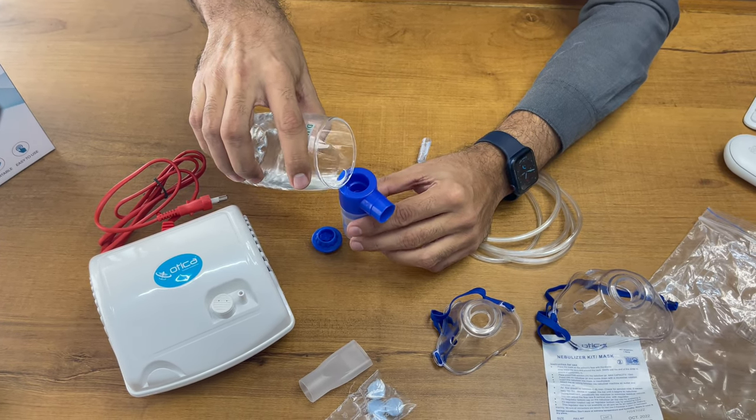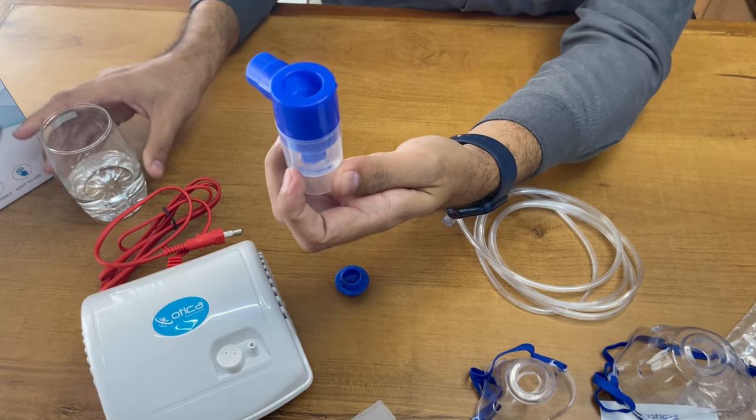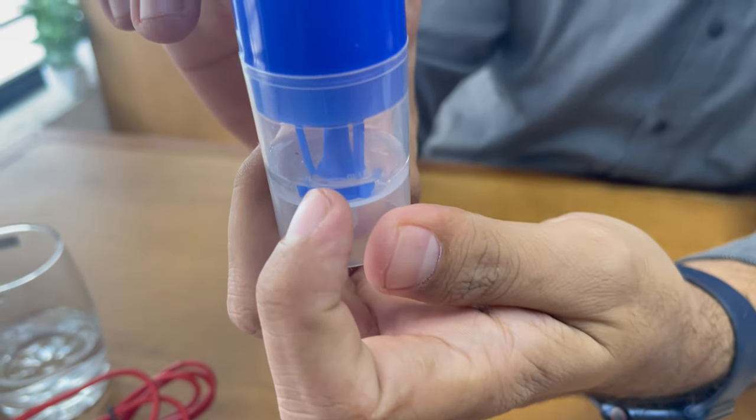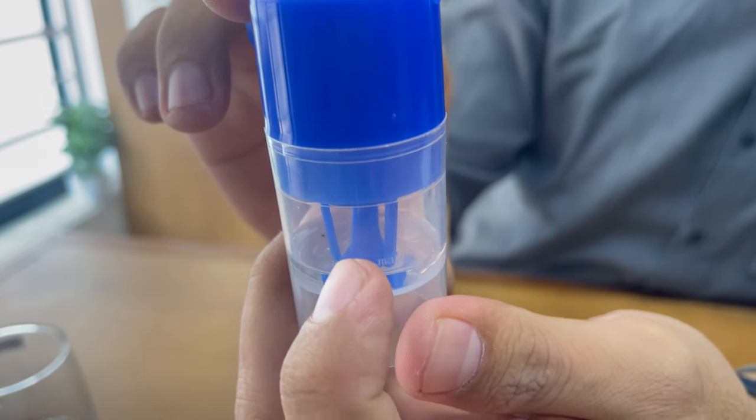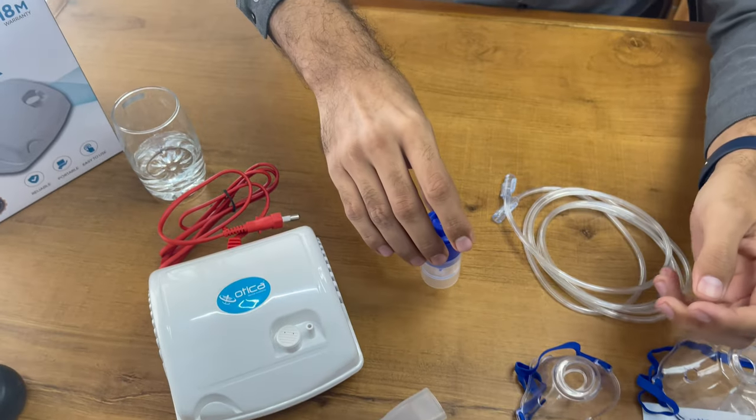Make sure you are putting the water in after removing the cap. We are just adding some water as a reference. You have to make sure to keep water between the minimum and maximum markings, and then apply the flow adjustment controller on the mask.